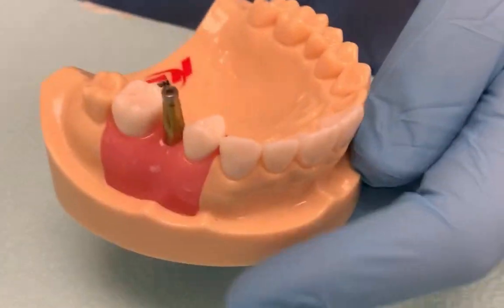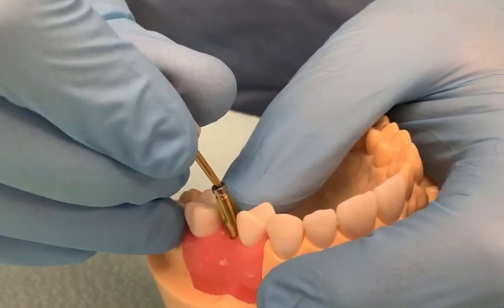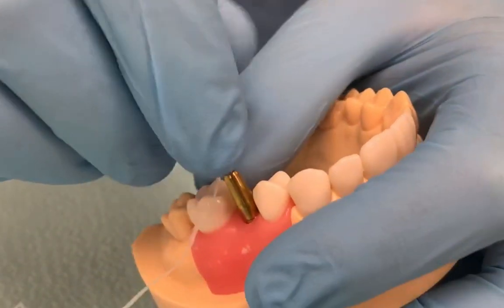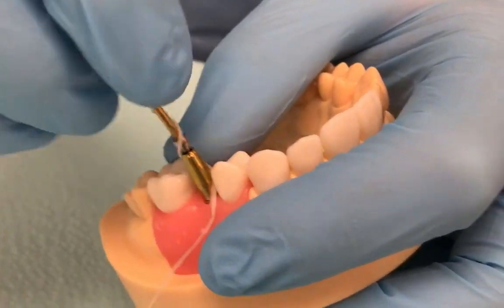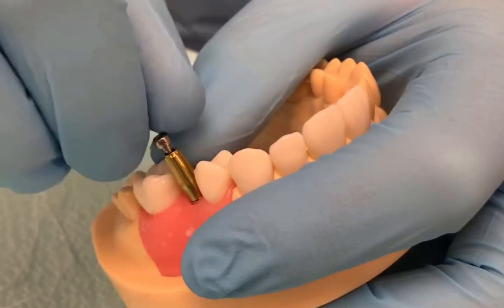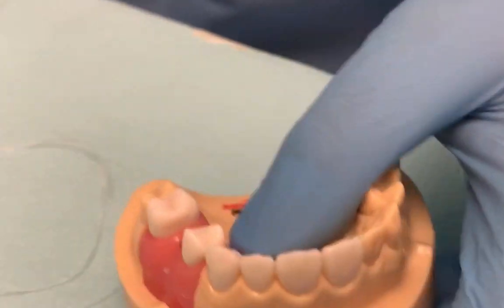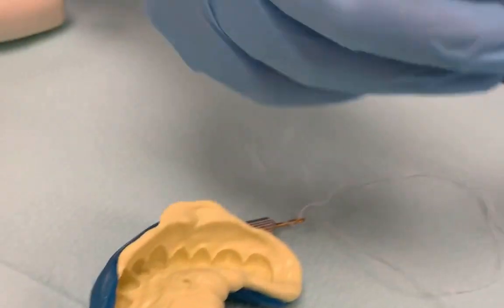And now we're going to take the driver and remove the impression coping — just like that. And then we're going to reattach the analog.